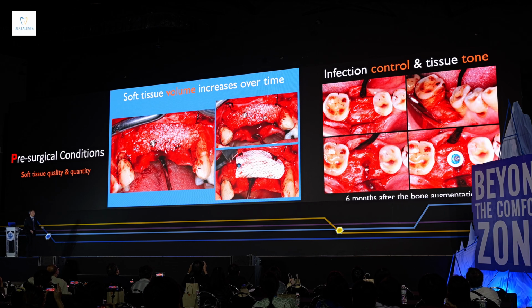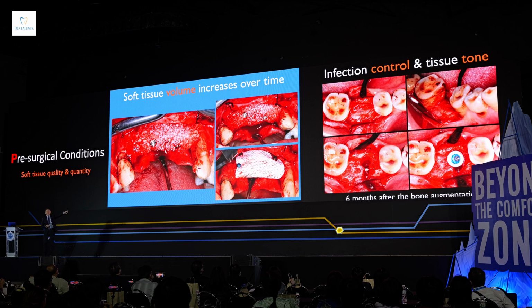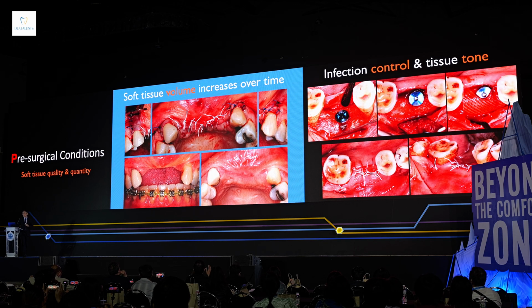Unlike the resorbable membrane, for the center one I used a non-resorbable membrane. Why is that? Because on this site so many surgeries had been done and all failed, so it's a chronic site. Because I had to wait this long, the healing potential decreased, and I was not able to use a resorbable membrane to achieve a better result. So I used a non-resorbable membrane, a titanium-reinforced one, and tenting screws to maintain the space. Then I sutured it up, both sides.